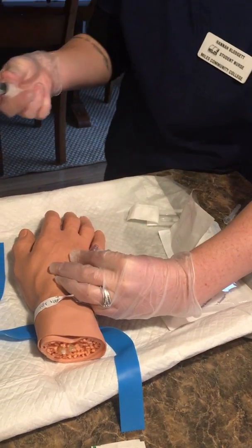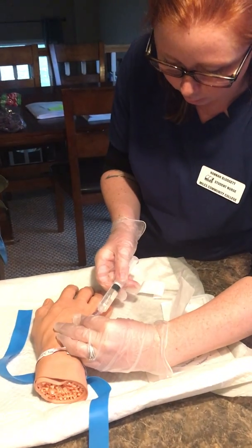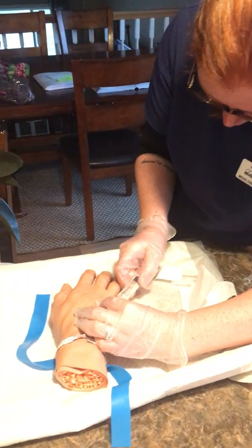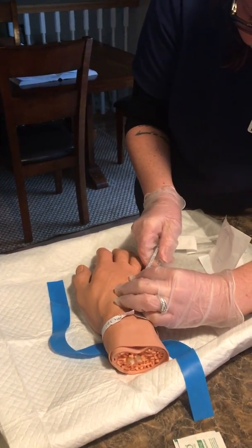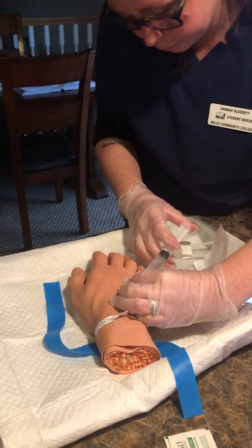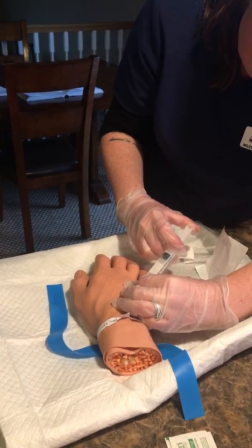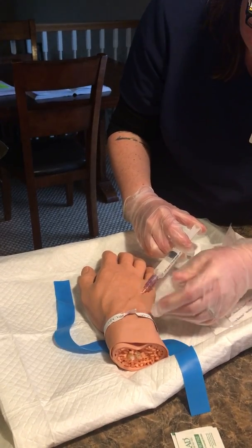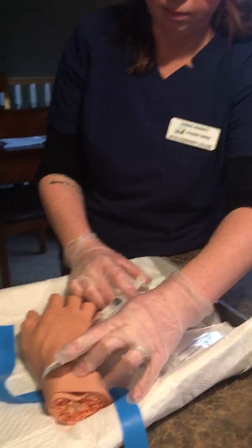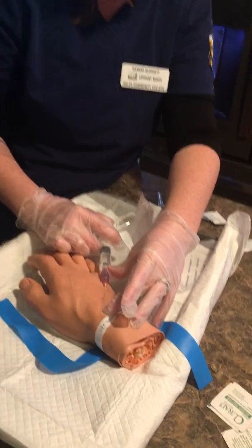I'm still going to make sure that's stabilized. I'm going to go ahead and flush this with about five mils of saline to make sure we have everything in working order. As I'm doing this, I'm going to watch for any signs of infiltration and make sure the patient isn't experiencing any discomfort.